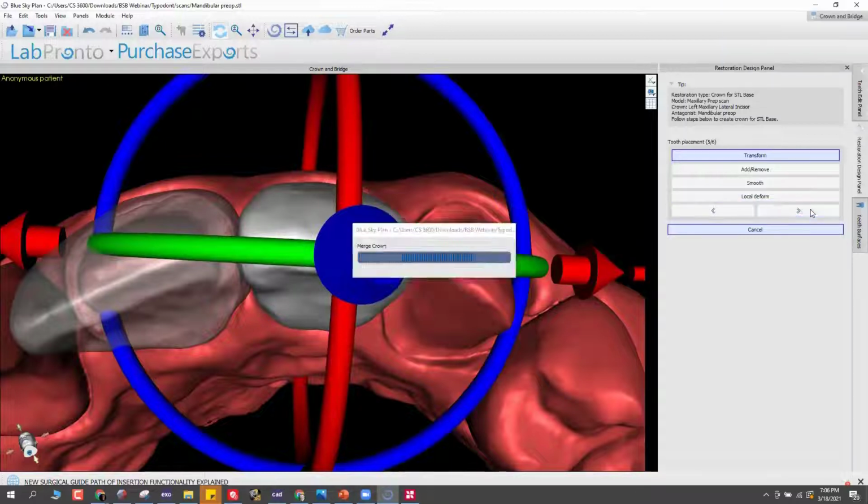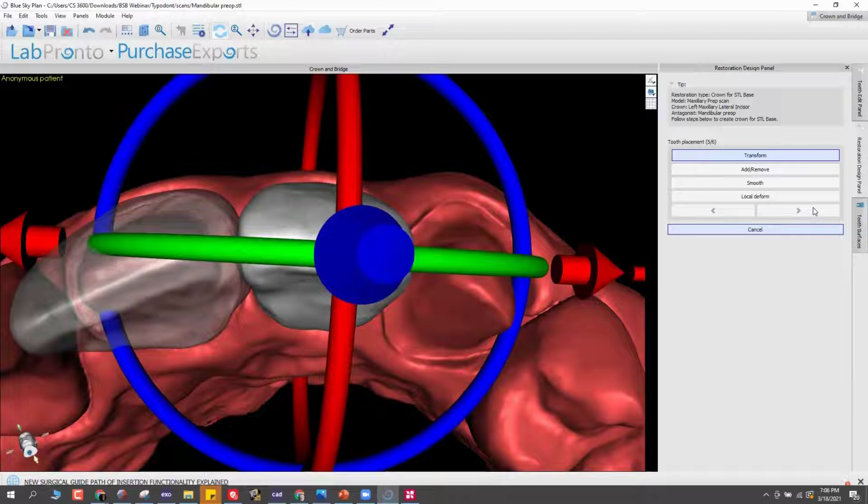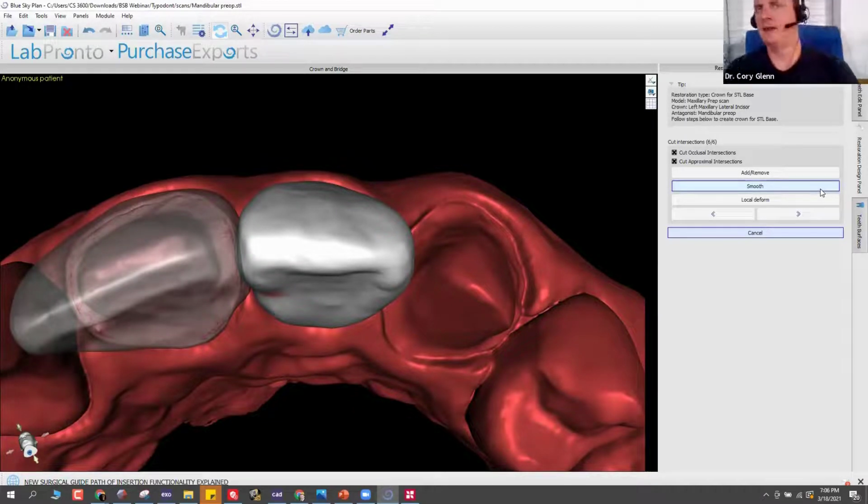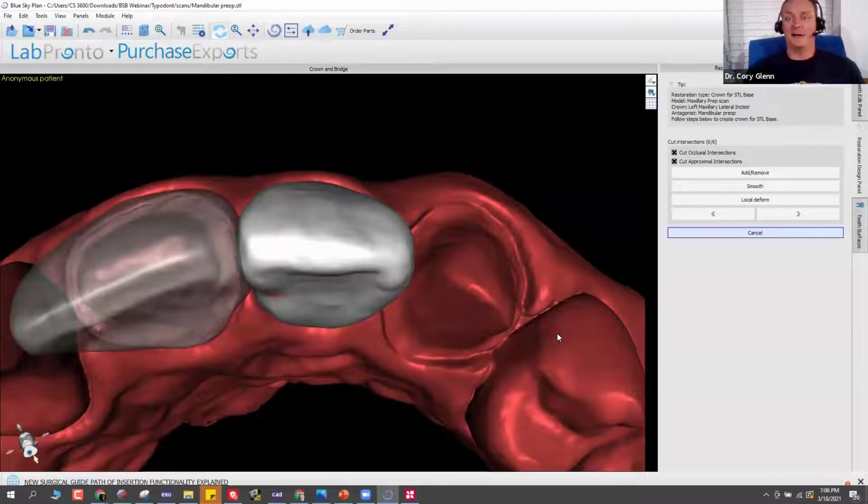What is the Envision Tech printer you were recommending? Any idea of that cost? And what about the shades of the resin and Vita based? I'm not sure about the Vita base aspect. The shades, they've usually got all of the A shades, and then a bleach and a B1, and usually an isolated C color.